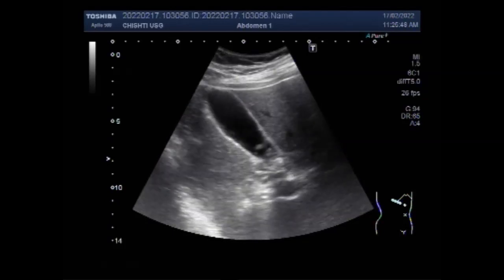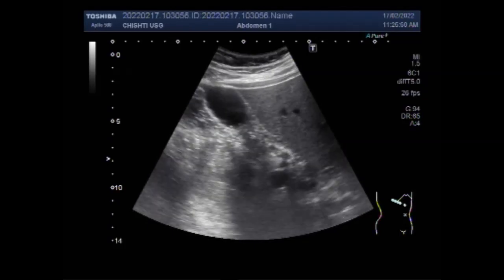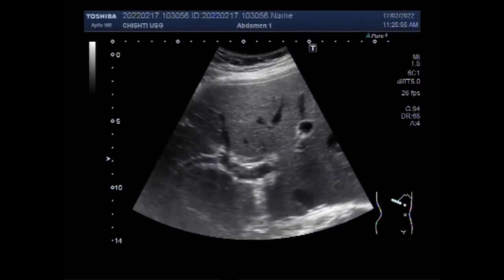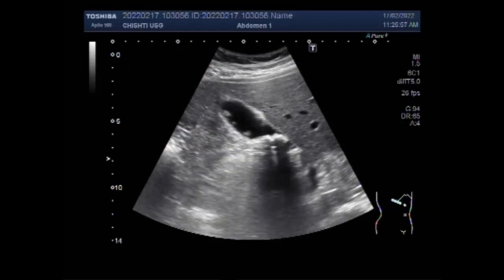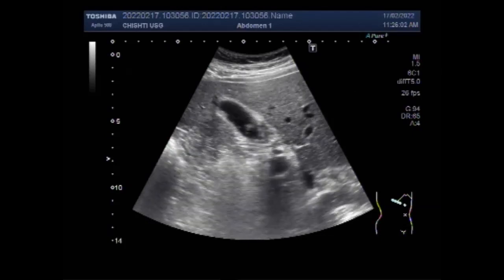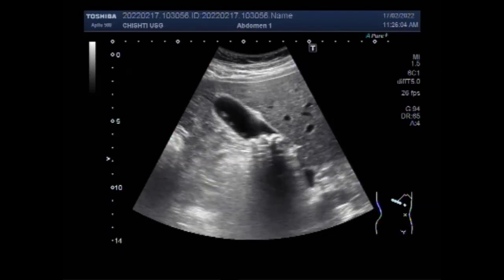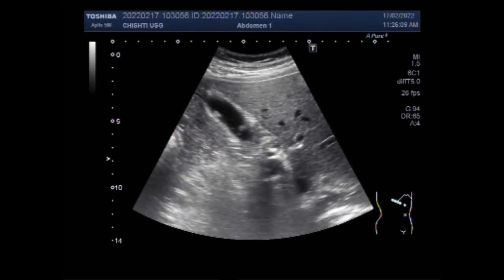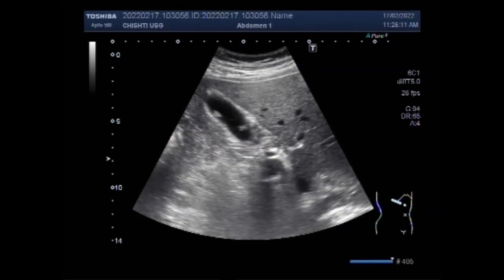Now you can see the multiple gallbladder polyps seen along the walls of the gallbladder. Usually these stones have strong posterior acoustic shadowing, but the polyps have no shadowing. And with the posture of the patient — as you can shift the patient from the supine position to the side-on — the gallbladder polyps will not go down towards the neck of the gallbladder.